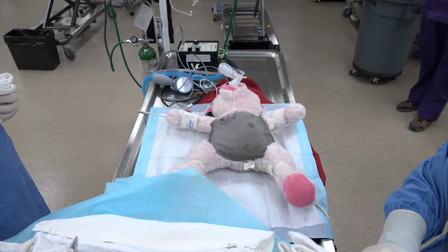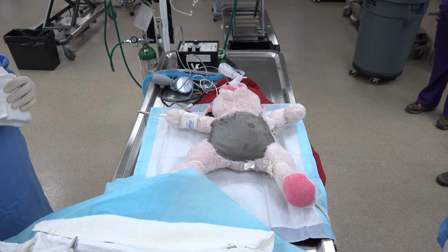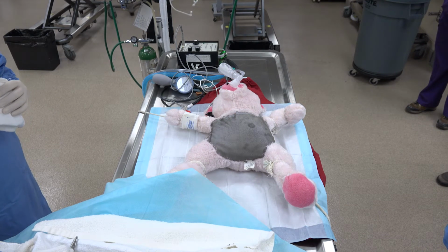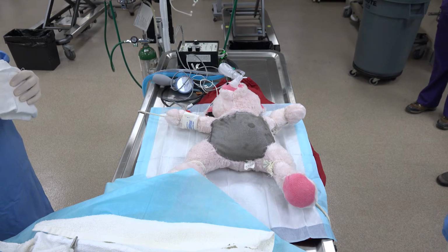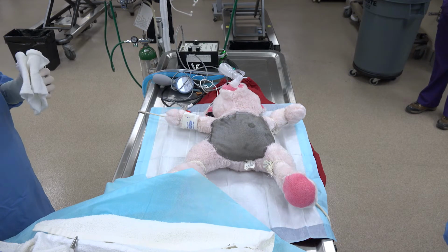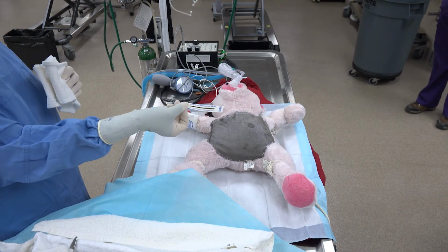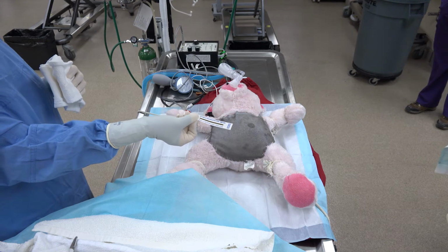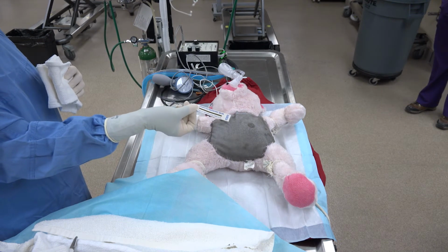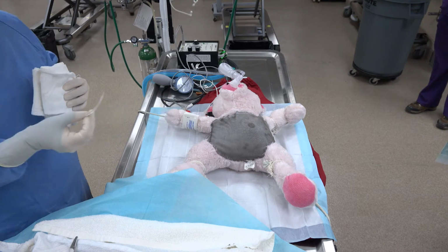Okay guys, now we're ready to drape. And so the first thing you need to do is open the inside drape of your instrument pack. Have somebody drop your scalpel blade and your light handle and any other things that you want them to drop on your table. You also go ahead and look and make sure that you have a sterile indicator strip on the inside that makes sure that the inside of your package actually got sterilized. So in this one, we're good to go.